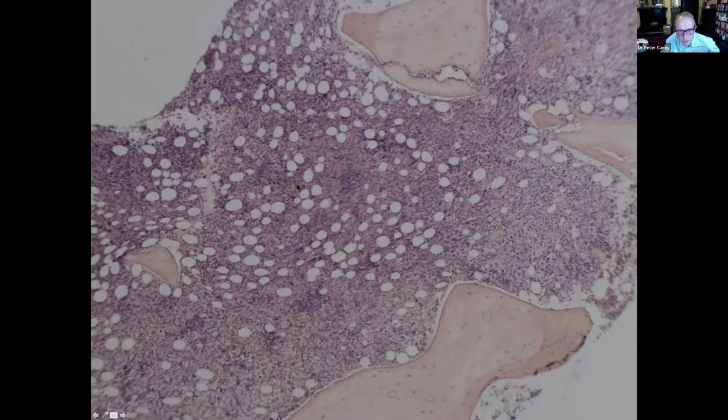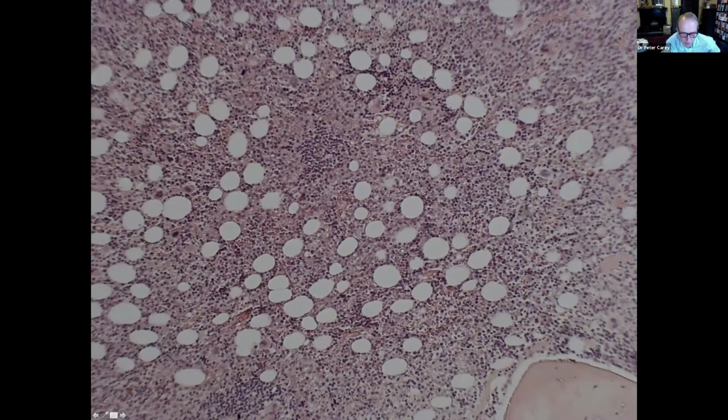There are megakaryocytes here. There are some aggregates of small lymphocytes that we can see at low power, and perhaps at slightly higher power here. And we can start to see there's a scattering of eosinophils around as well. Lots of megakaryocytes, some maturing granulopoiesis, lots of nucleated red cells. But these aggregates of lymphoid cells, they're not paratrabecular, they're quite small, they're rounded, they could well be reactive, or they could well represent recurrent lymphoma, which was the clinical question.